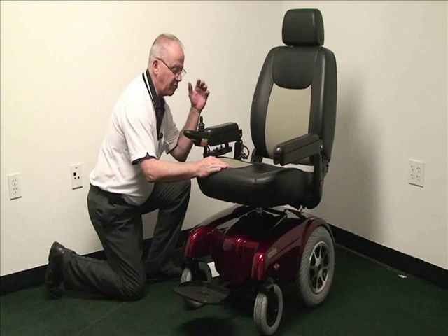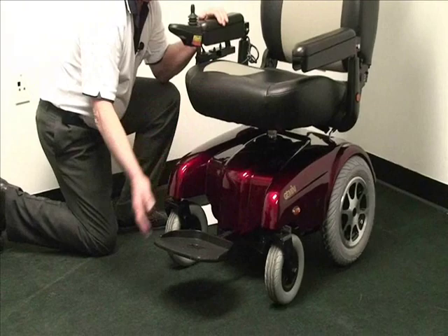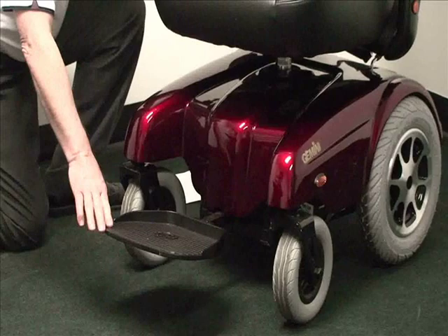The P301 features a unique suspension system with a 450-pound weight capacity. It also features an aluminum flip-up footplate with height and angle adjustability for various comfort positions.